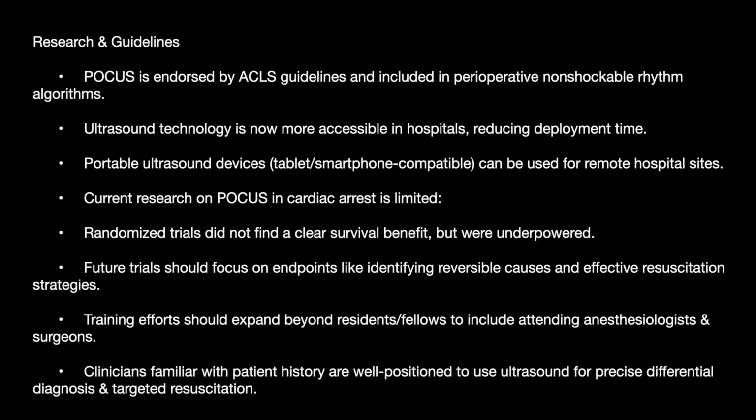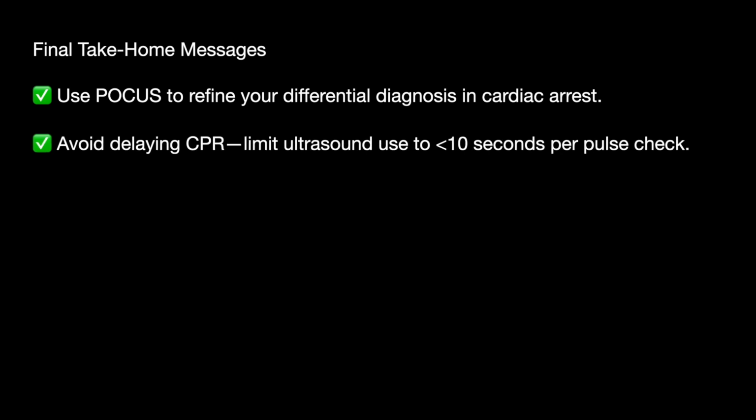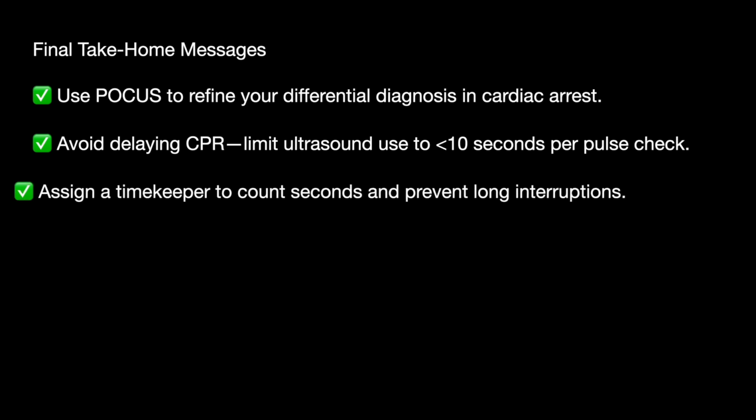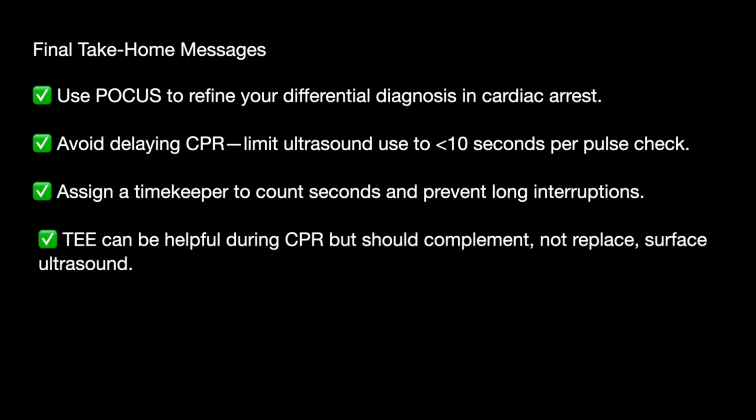A clinician familiar with the patient history is well positioned to use ultrasound for precise differential diagnosis and targeted resuscitation, because history is paramount. Without history, we are just blind. So the take-home message is to use POCUS to refine your differential diagnosis in cardiac arrest, avoid delaying CPR, and keep the interruption to less than 10 seconds. Assign a timekeeper who will count out these seconds loudly and prevent long interruptions.